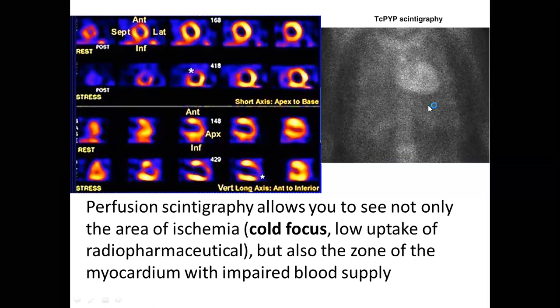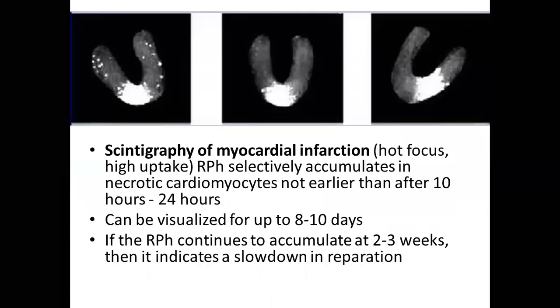This is how scintigraphy without PET, without CT scan, is going to look like. So you will see this heart and these small flashes of gamma radiation emitted from the radioactive element. Then we catch these flashes with a gamma camera. This is the opposite imaging.